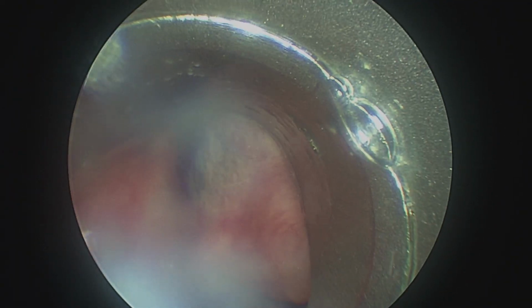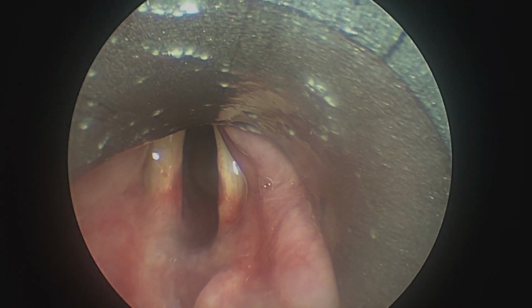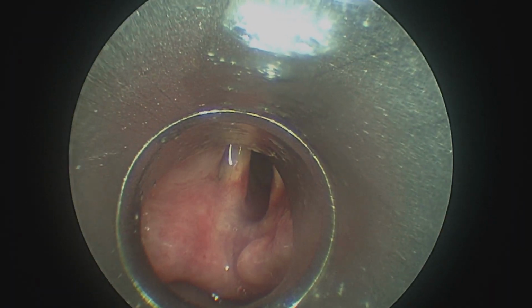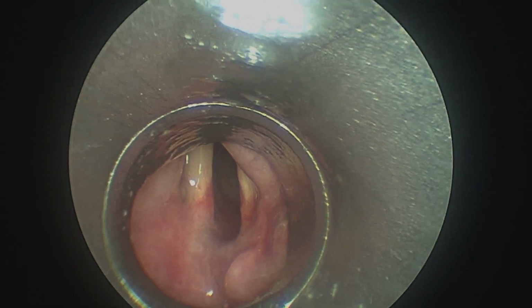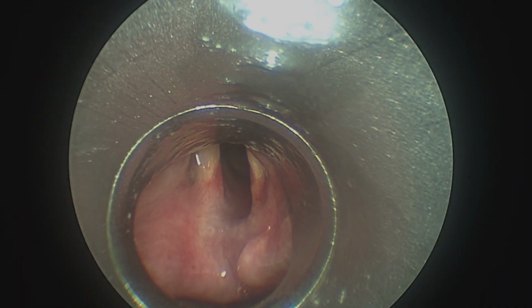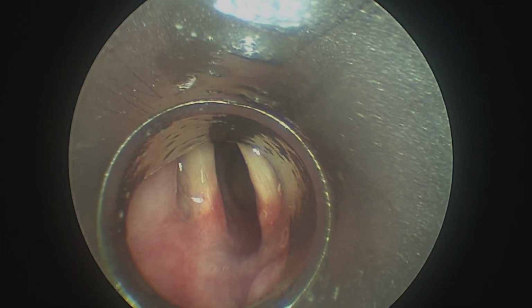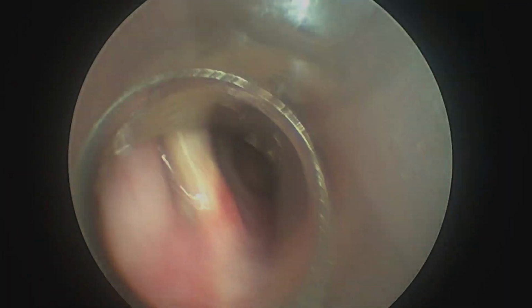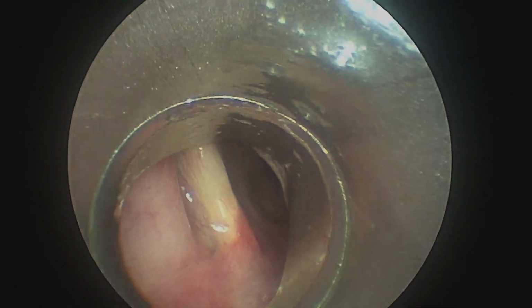You can push the camera to just clean the surface of the camera. Yes, ma'am. So once we go little more, pull the telescope. Slowly move towards the vocal cords. At the vocal cords, rotate the barrel, so that the bevel passes between the vocal cords.